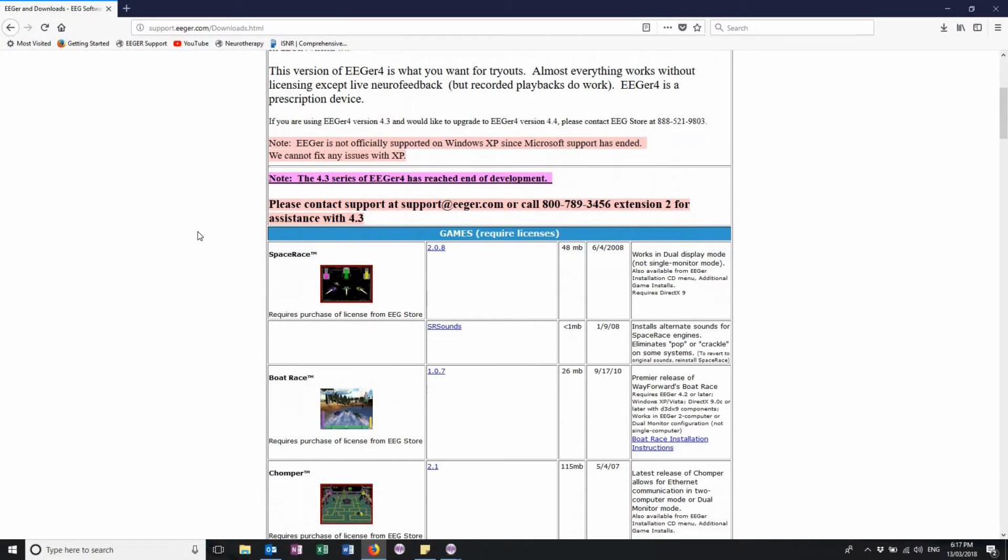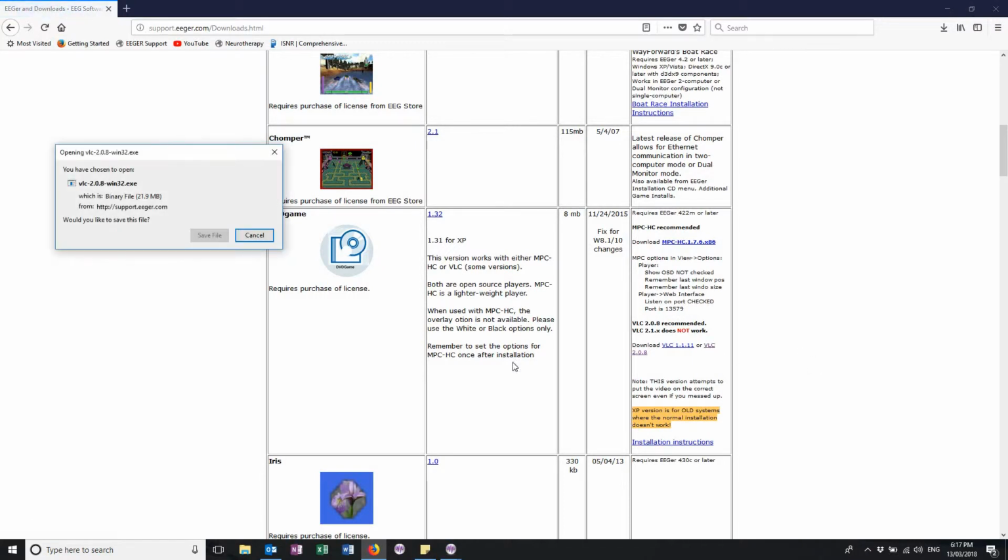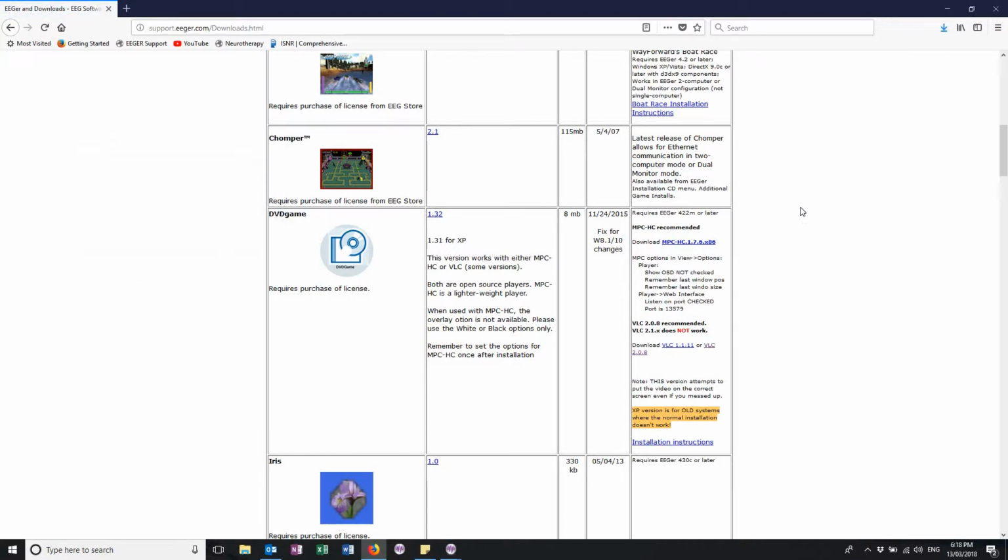And then you come here and you see a list of the different games. And for DVD game, you see 1.32, which is the latest version of the DVD game. And in the right-hand column, you have the different media players you can use. And right here you have VLC 2.0.8. So you click on that and you click Save File, and it'll start downloading. Now I've already downloaded this file before, so that's why it's saying that's completed. So you go to your downloads folder, or you can find it within your browser, and you click Open that file.